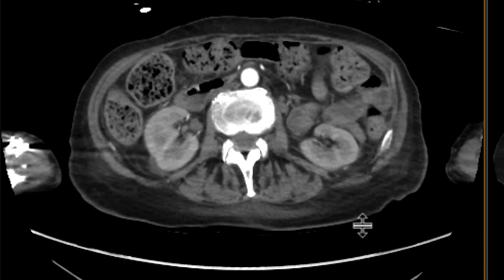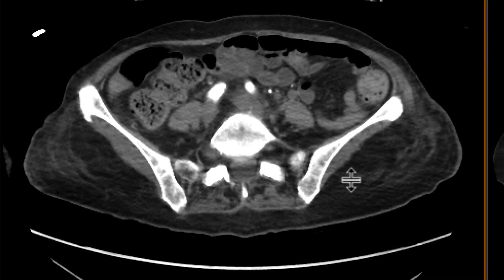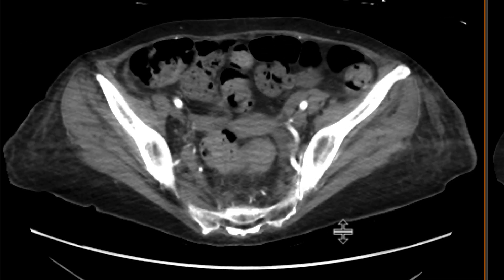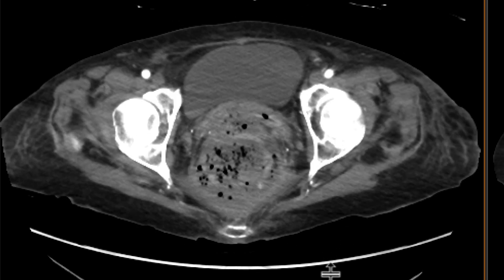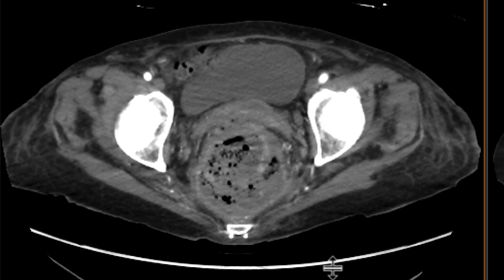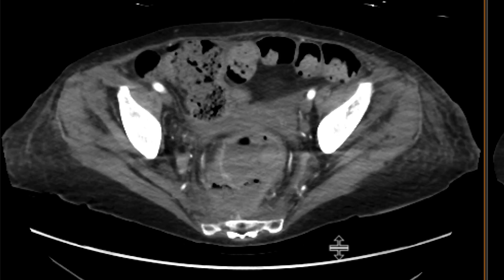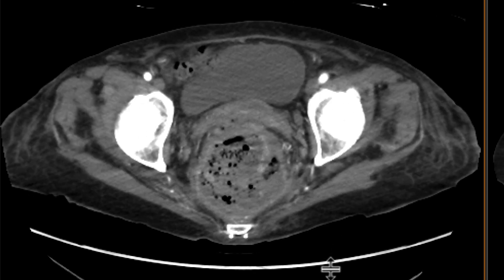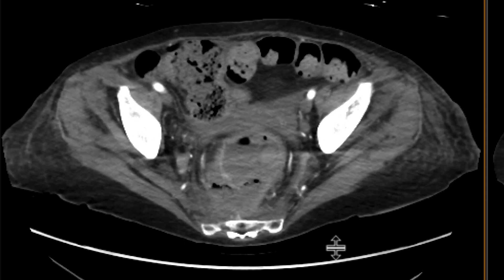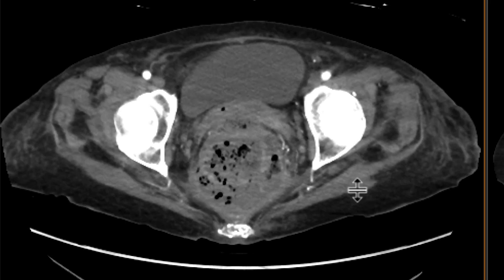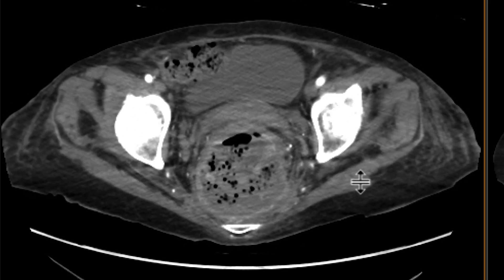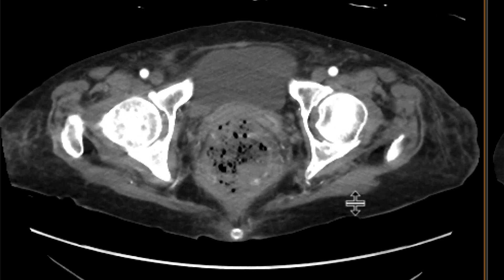In the arterial phase, we're not seeing any active bleeding as we scroll downwards. But again, as we get to the rectum, we see that it's thickened — there's all that stool there and a lot of inflammatory change. In fact, there's disruption of the rectum as well over here posteriorly, with this collection containing stool and fluid posteriorly.